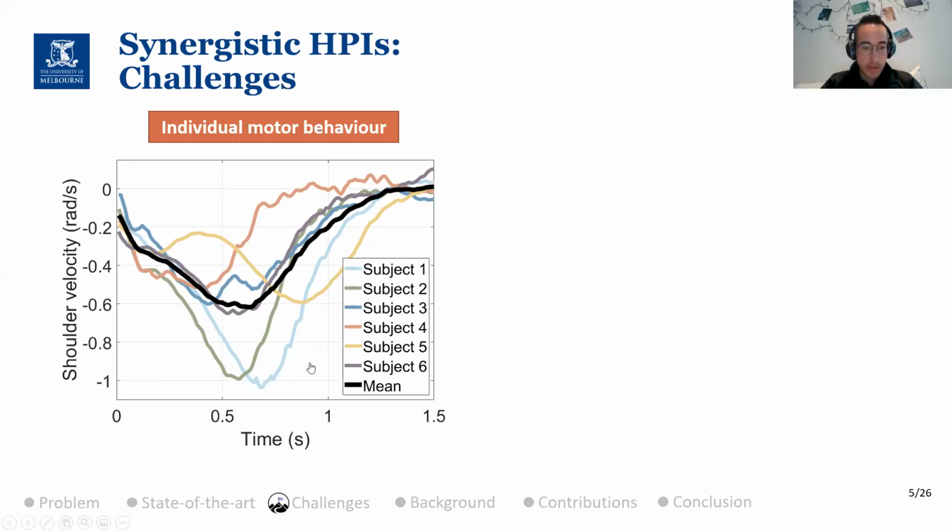Well, anyway, hopefully you can see the one that is a bit purple. That one would work really nicely, right? It's pretty much overlapped by the mean. But if you were to use one of the sky blue ones, then your estimation would be a bit off, right? So that is one of the main challenges.